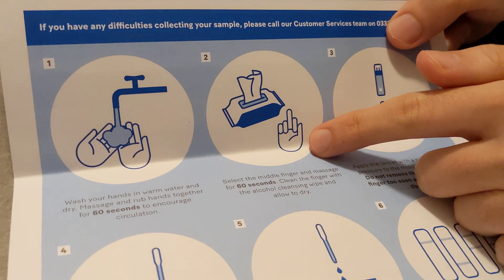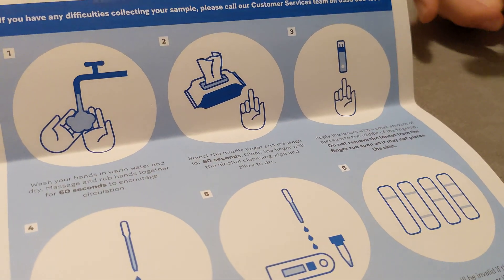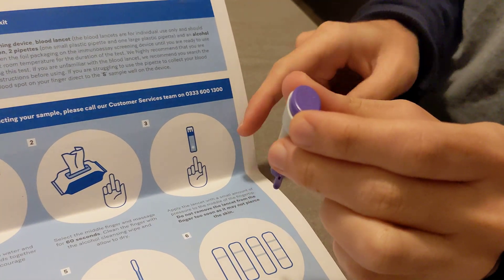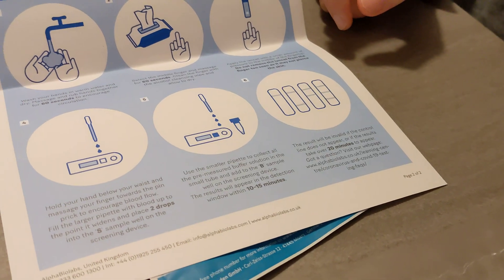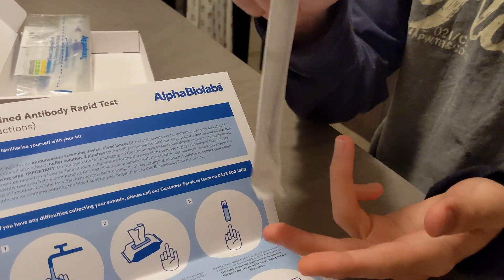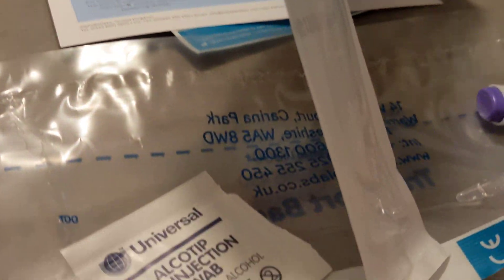Then you should take your middle finger and use this lancet on your finger to take the needle and draw blood from your finger. Using this, you're then going to collect the blood from your middle finger and place it in the S slot.